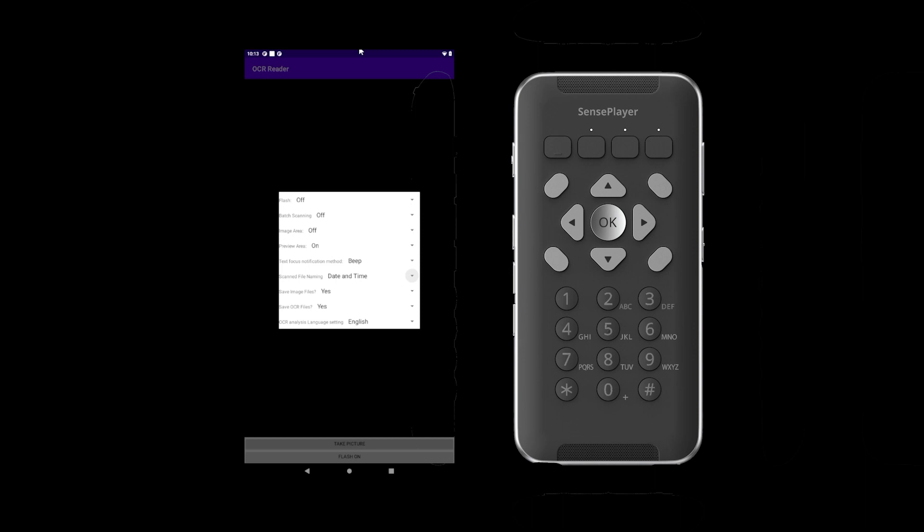The next option is scan file naming, where you can scroll between ways to name your files using the left and right arrows. The next option is save image files — choose between yes or no depending on whether you want to save your image files. The option after that is save OCR files — toggle between yes and no. The last option is the language setting, where you toggle between languages to set the language of the document you are scanning. When you have chosen your settings, save them by pressing OK, or return to the OCR menu without saving by pressing Cancel.